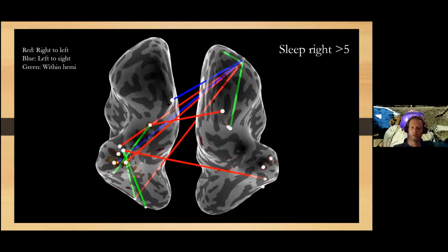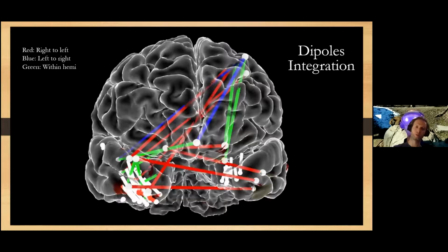And just to show you, when we go to the PL mode, here I also import the dipoles. The dipoles are the white pipes here. So we can see that the location of the dipoles is highly correlated here. And here it's correlated, but it's a little bit far from the nodes. And it's a good point to understand that dipoles are volumetric methods, meaning that the dipole field gives us a voxel that doesn't need to be necessarily on the surface. It could also be underneath the surface or in deep structures.